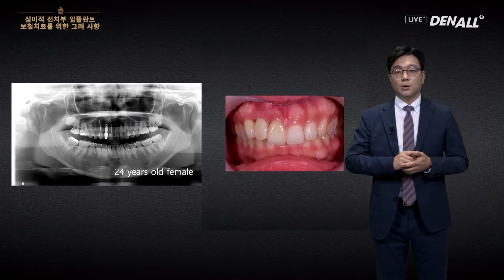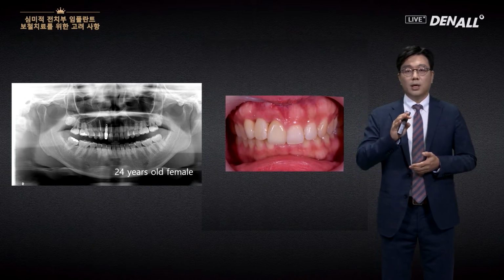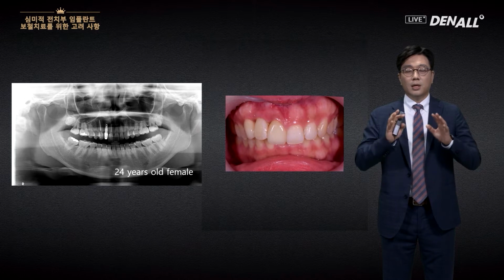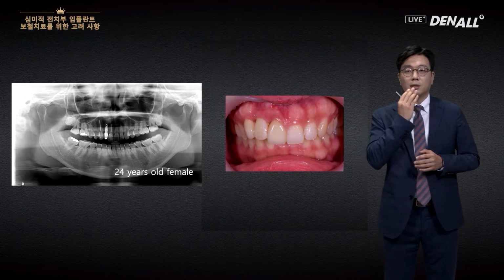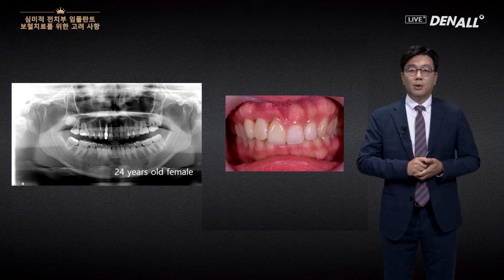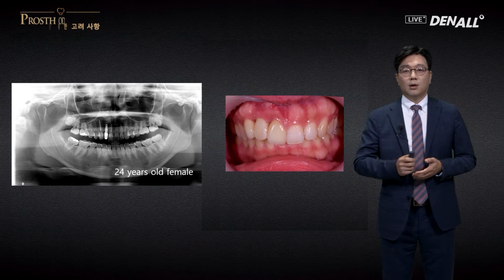A 24-year-old female. The implant is placed. Everything is okay, except the problem: in the lip and on the labial side between 11 and 12, food is retained. That is the complaint.